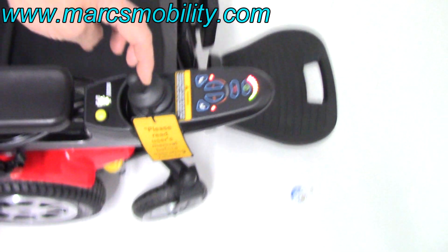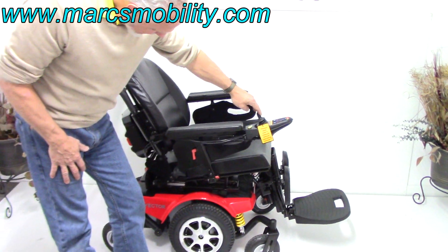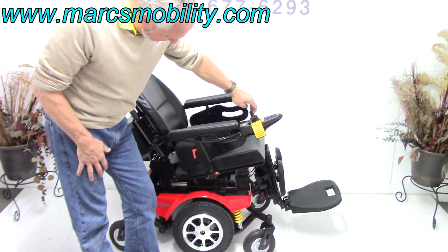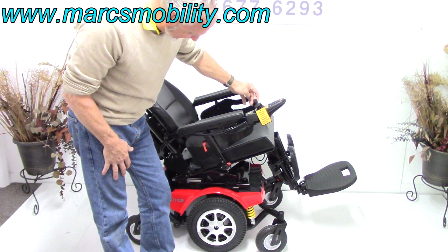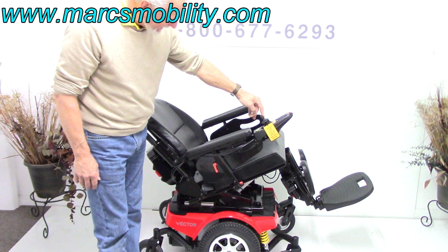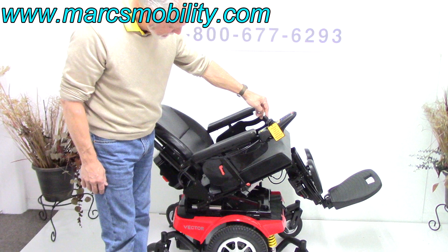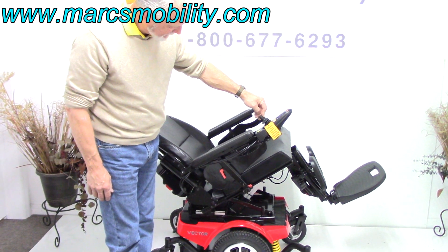I'm going to pull the joystick back and make the seat tilt. This is your electric tilt with the Merit Vector power chair that has less than two miles and is in new condition. That's your electric tilt — and that's a full electric tilt, by the way.